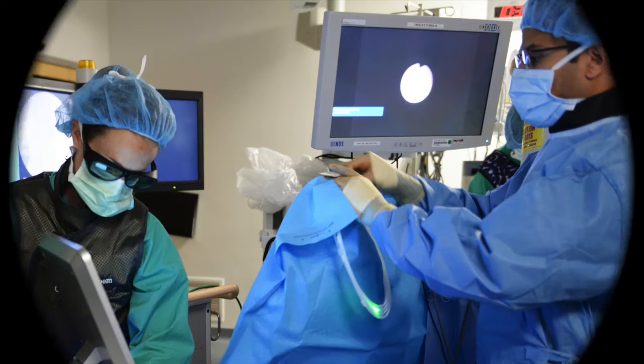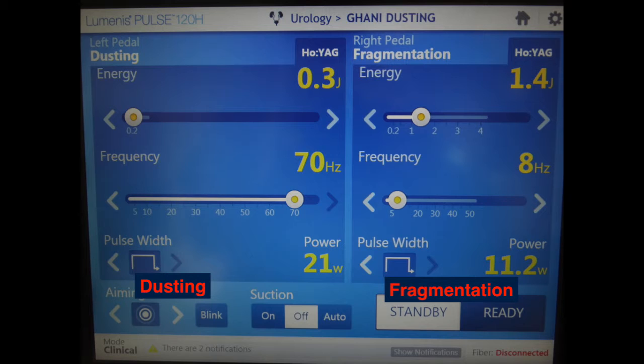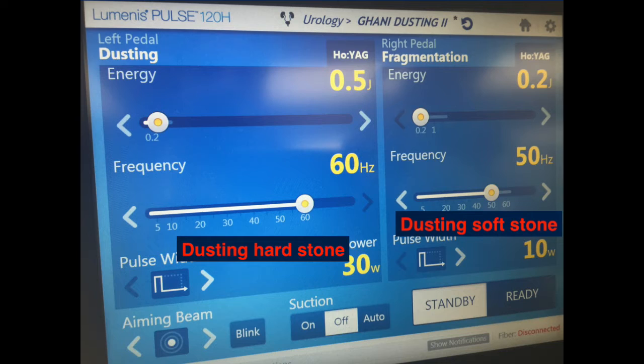We used a 100-watt or 120-watt holmium laser from Luminis. The 120-watt system permits dual lithotripsy modes of fragmentation and dusting, which allows for instantaneous switch from one laser setting to the other without the need to put the system on standby. It also allows surgeon-specific settings, where dusting settings can be specified according to the hard or soft stone composition.